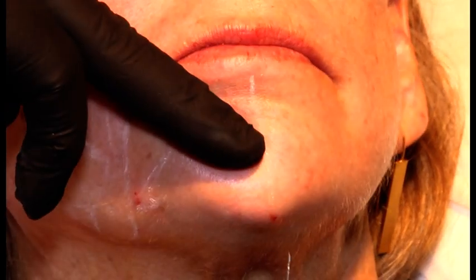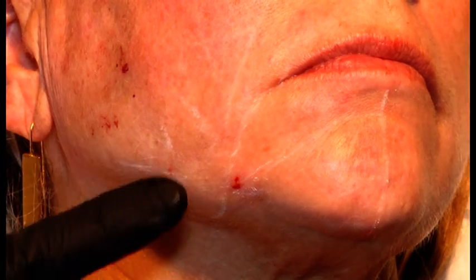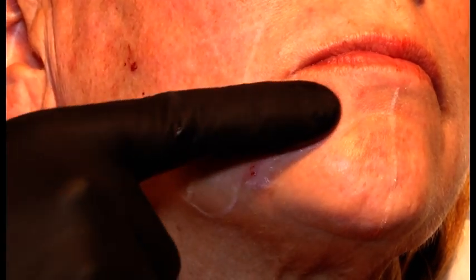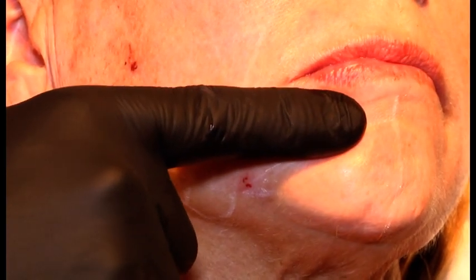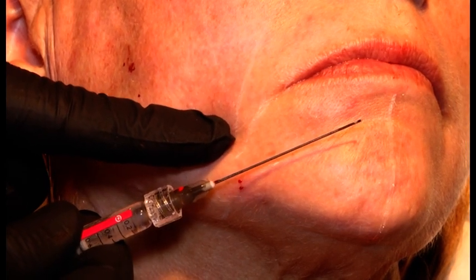Now, why do I use this medial one for submuscular and this one for subcutaneous? The reason is that if you think about the facial artery running up here, the inferior labial artery running this way is located submuscular in most cases. And it is running parallel to the cannula if I come from here.